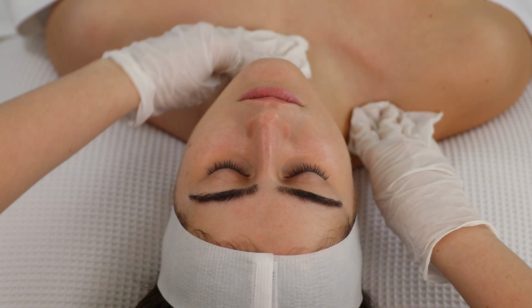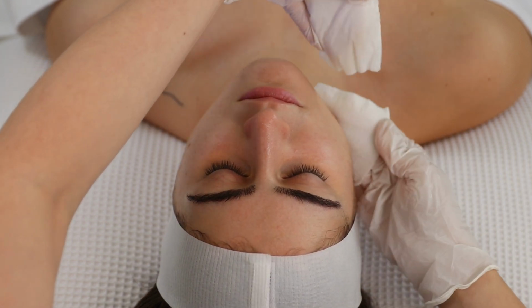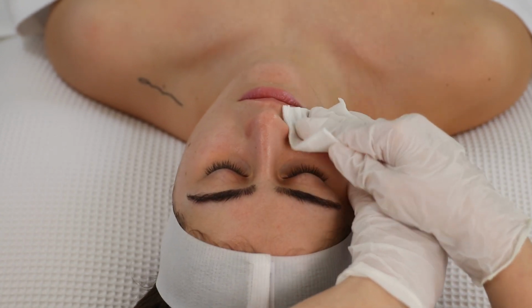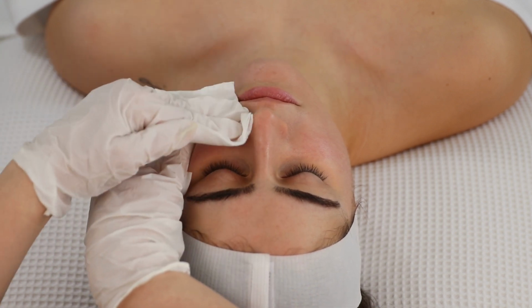You are going to slowly move on to the neck area, using sliding movements, starting from the right, moving to the left, going upwards towards the face. And for the face, start from the right side, one hand gliding up, followed by the other. Slowly make your way up towards the cheek, and then move on to the other side of the face and repeat the exact same process.